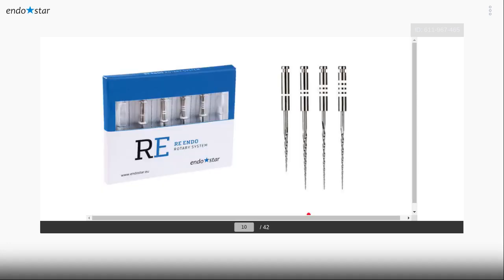As I told you, today I will talk about using Reendo files and Azure files, and why I'm using them. Reendo files, you know, are made of nickel titanium, and if you check what kind of ISO they have, all of their tips are 30, and they have only different tapers.